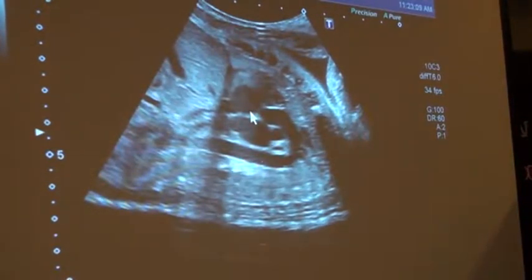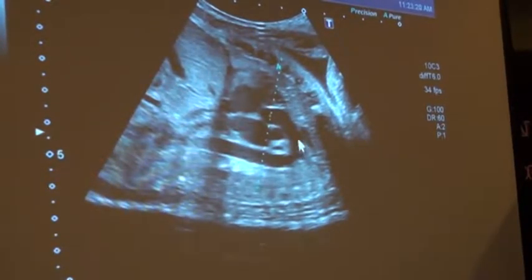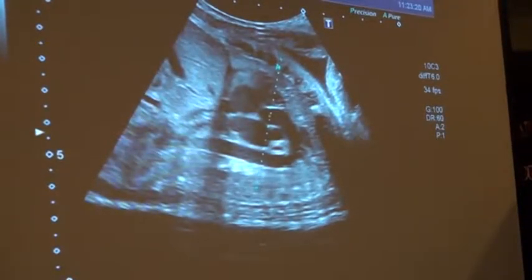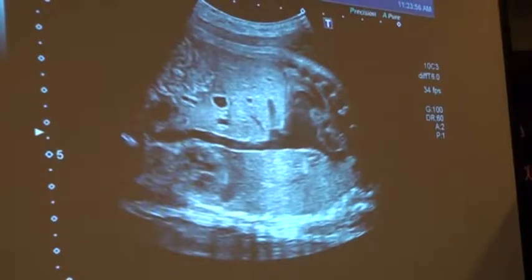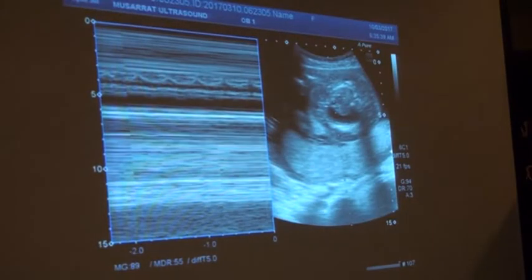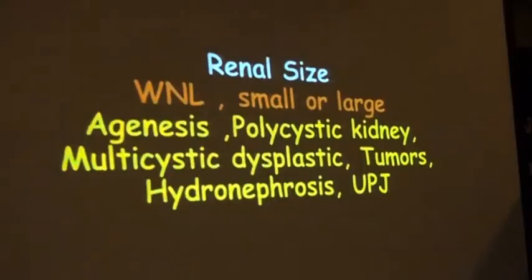And one thing, what is the measurement? You take the measurement from the chest to the spine right here, and this curve of the arch of the aorta should be in the center. So you measure from here to here, you measure from here to here, means the arch of the aorta is coming in the center, means normal aortic arch. And that's again the SVC and IVC. I've just turned that image upside down to make it a bull's horn appearance. M-mode has already been taught very nicely, so I'll skip that.